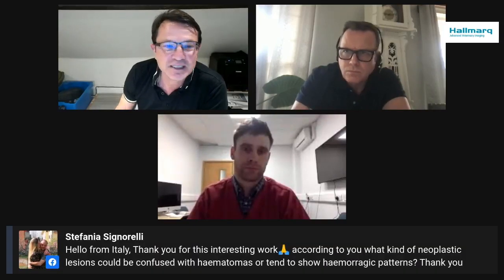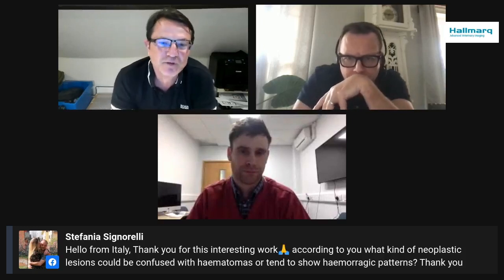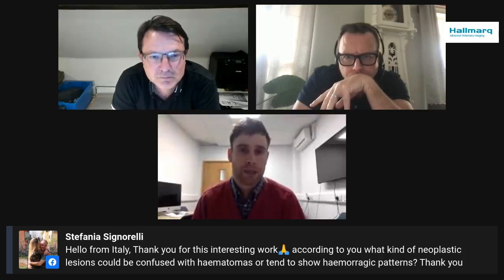We move to Italy, Stefania. According to you, what kind of neoplastic lesion could be confused with hematoma and tend to show hemorrhagic patterns? So we kind of cover that. As we've already said, high grade metastatic and intra-axial neoplasias of the brain, I think, could all appear like this.